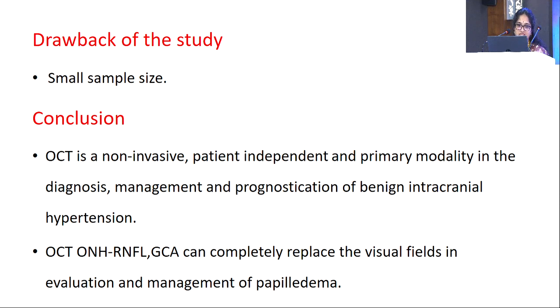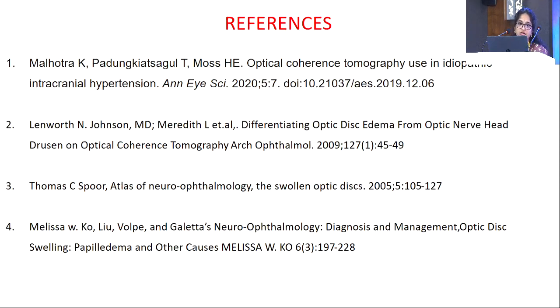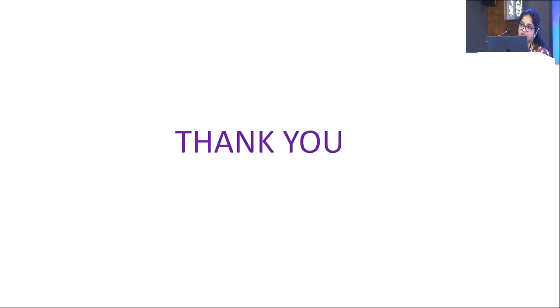Drawback of the study is the small sample size. So conclusion is OCT is non-invasive, patient independent and primary modality in diagnosis, treatment and prognostication of benign intracranial hypertension. OCT, ONH, RNFL and GCA can completely replace the visual fields in evaluation and management of papilledema. These are my references. Thank you.